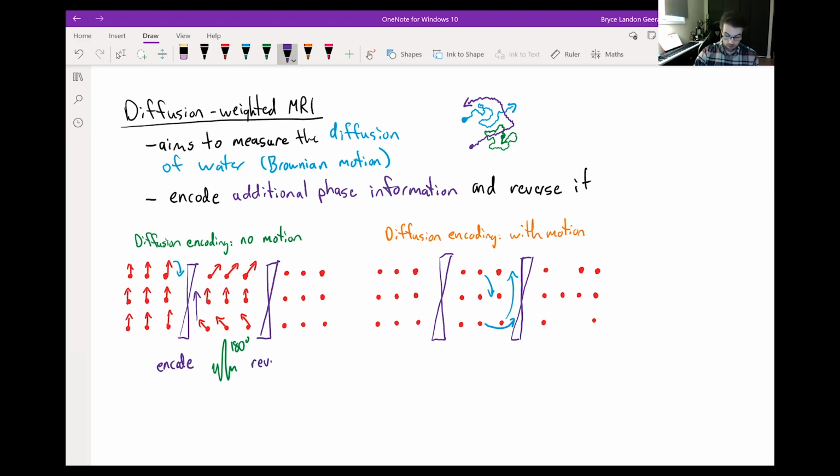So that's what's happening in between step 2 and step 3. We have that exact same gradient, and it's going to reverse our phase information for us. That's because in spin echo, when we do that 180-degree pulse, the top row, which was ahead in phase, is now going to be behind in phase, and the bottom row switches as well. I'm not going to draw that out, but that's the reason for the 180-degree pulse.